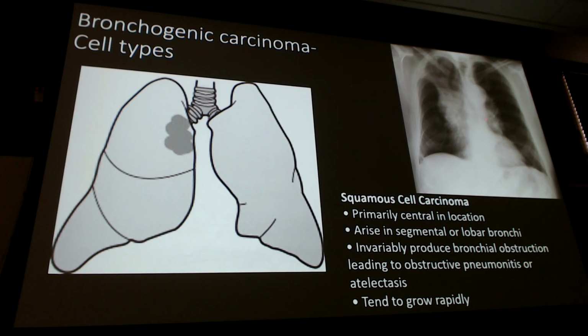And you get this x-ray, and then the question is something along the lines of, what is the most concerning abnormality on this x-ray, right? So I give you, say, the 4 different types of carcinoma and atelectasis, because atelectasis is here, but definitely not more concerning than the cancer that they have. Just a way for you to kind of piece that out and what some of those harder, distractor type questions might look like. Okay, still haven't created you guys. Just been teaching it long enough to know some of the things that sometimes come up on there.